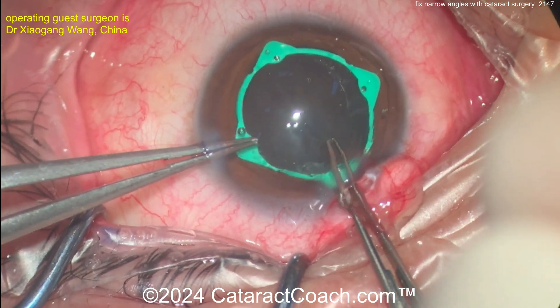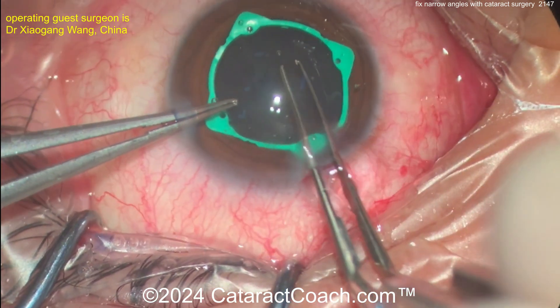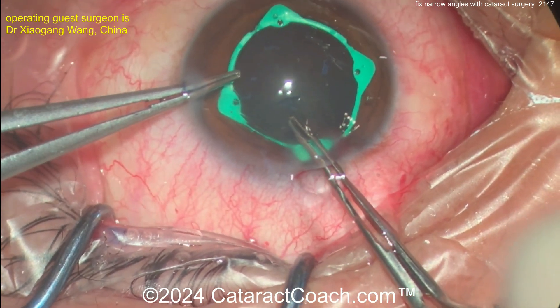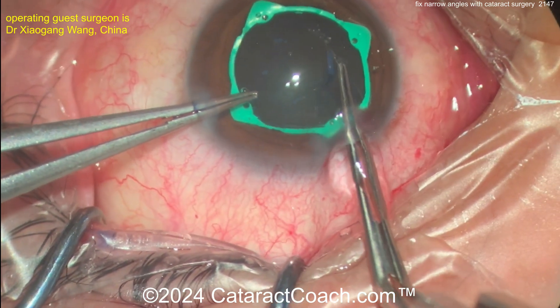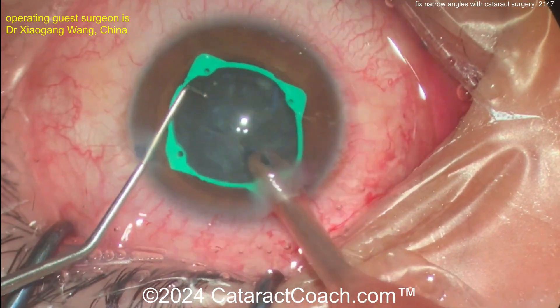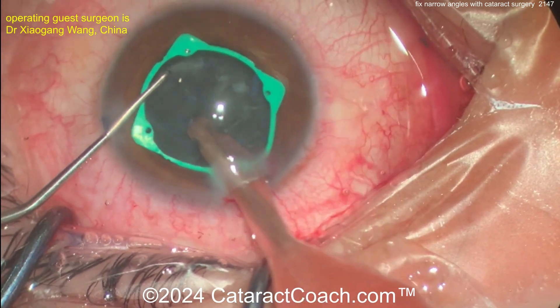Think about the anatomy. You do biometry on these patients and it tells you the anterior-to-posterior thickness of the lens. Patients with lenses that are even five millimeters thick — a very dense nucleus, a mature cataract — can have an anterior-to-posterior dimension of five millimeters. Four and a half is very typical, and that's really pushing forward on the iris and narrowing out the angle.